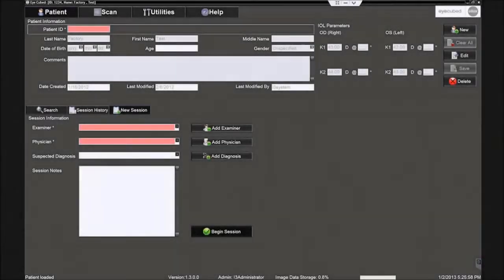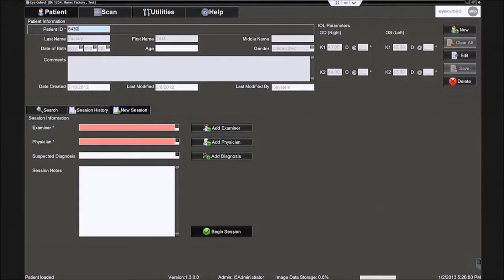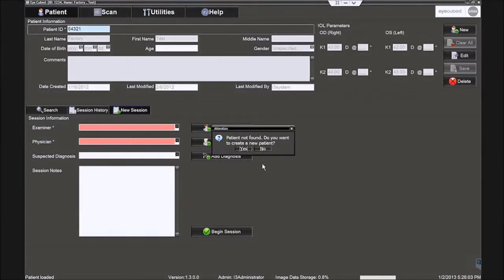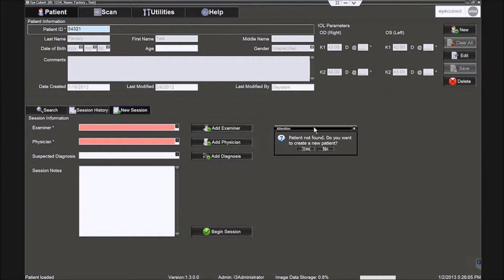The patient screen is displayed. Type a patient ID and click enter. With an existing patient, the previously entered data will automatically display.